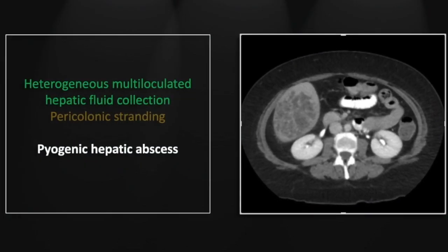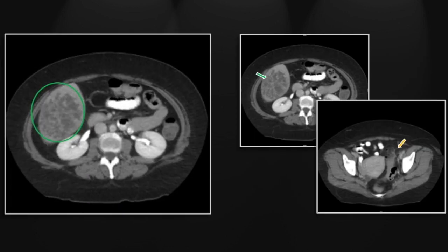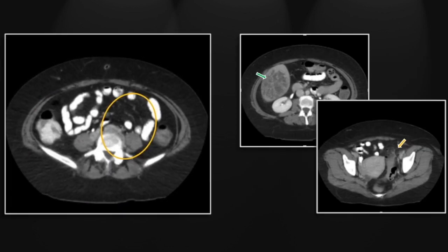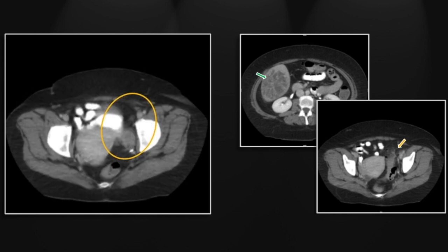Our next case is a straightforward pyogenic hepatic abscess. It's worth noting that these abscesses tend to be multiloculated and very complex in appearance, yet still are typically just E. coli infection from diverticulitis or colitis — clearly the most common source and clearly the case in this instance. Again, that multiloculated complex fluid collection within the right liver lobe and the diverticulitis with stranding in the left lower quadrant.